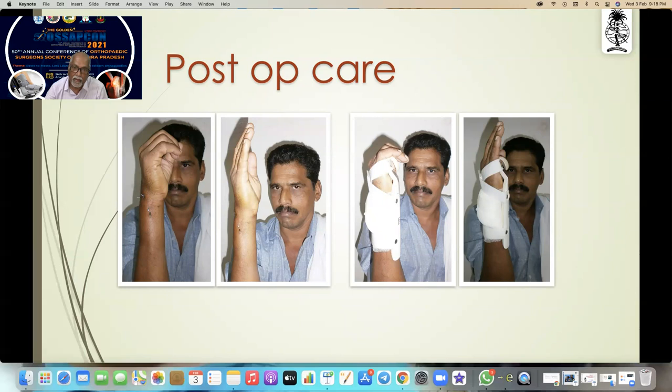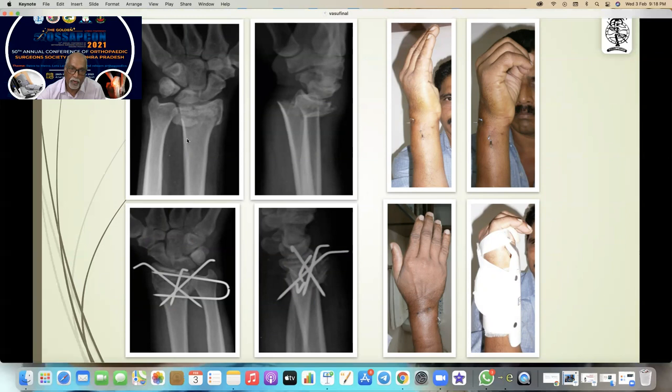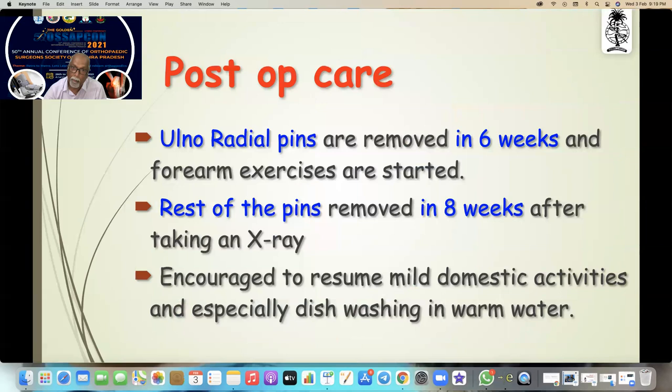This is the spring which I am giving, and that is how they remove the spring and move it. Before reduction, after reduction, five-pin fixation — this is immediately after fixation. This is the eight-year follow-up function.